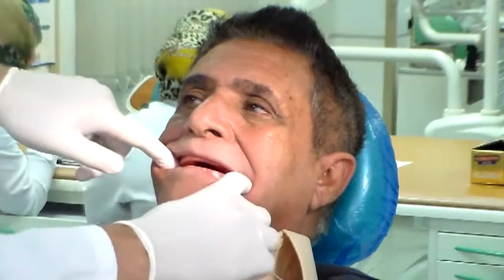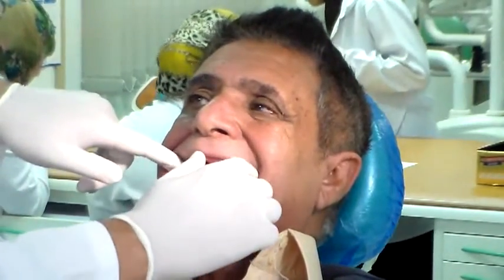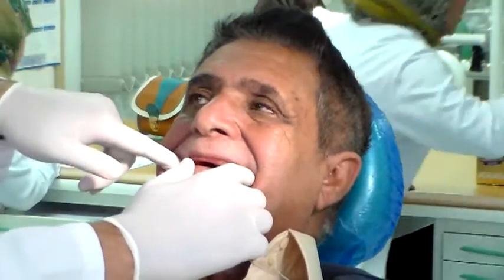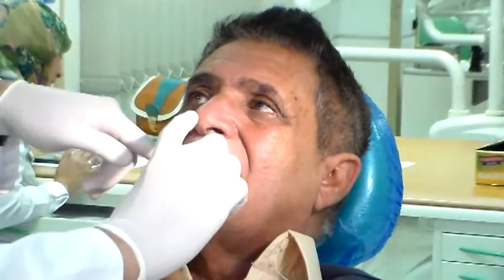Now, as you see the patient closing, this side is touching, and all of this is open. Then you have two options to correct this. You can either add wax here, or you can reduce the wax here. Which one will you choose? The way to choose it is to know the vertical dimension.